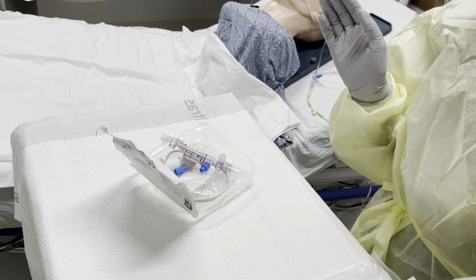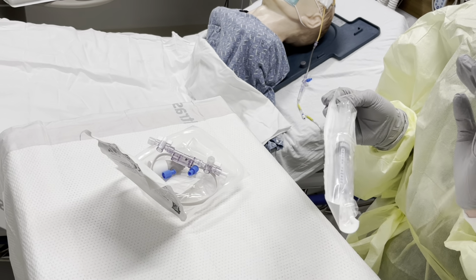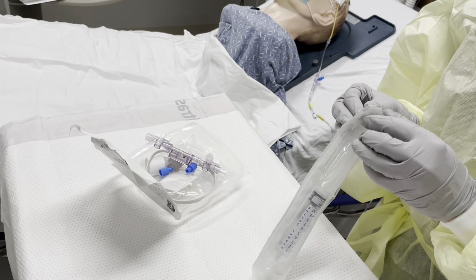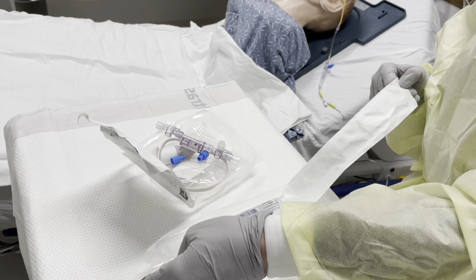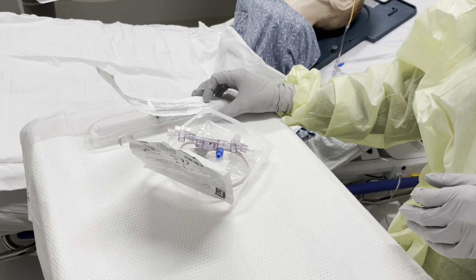And if you need extra equipment or anything like that, extra supplies, you can always reach out and ask somebody. The next thing I'm going to do is open my sterile saline. Typically, you're only going to need one flush. I bring anywhere from 1 to 3 just in case. And you're going to go ahead and open. I like to hold this part right here, and I just keep it nice and sterile. Just like that. You can keep that top on it, that's fine.